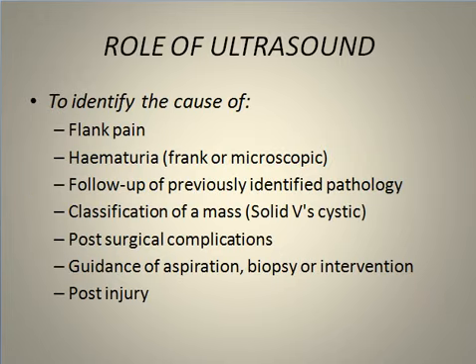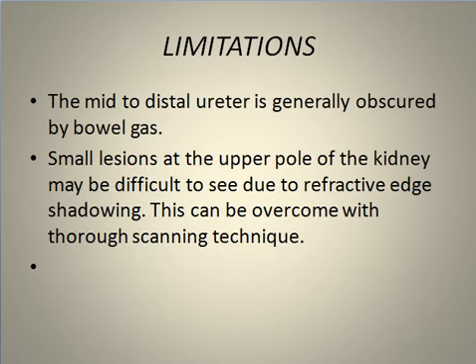Before the protocol, we should identify why we're doing the ultrasound of the kidney: patient with flank pain, patient with hematuria, follow up previously identified pathology, classification of mass if it is solid or cystic, post-surgical complication, guidance for aspiration, biopsy or intervention, post-injury.